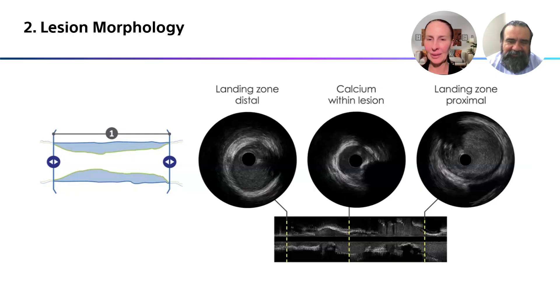As was discussed, you can find your distal landing zone and your proximal landing zone where you've got fairly healthy tissue, and then you can see the calcium within the lesion. So you know exactly what amount of artery you need to cover with that stent to treat all of your disease.